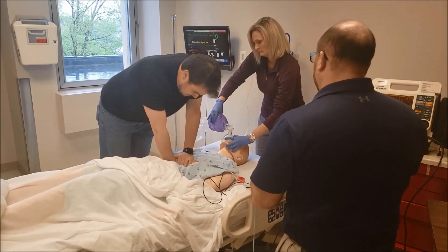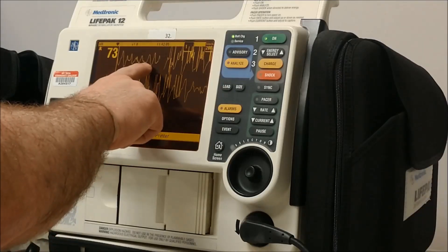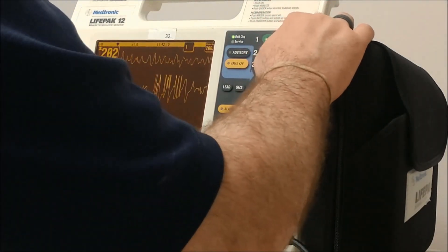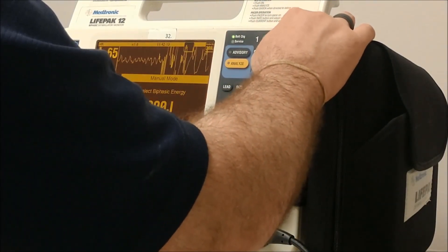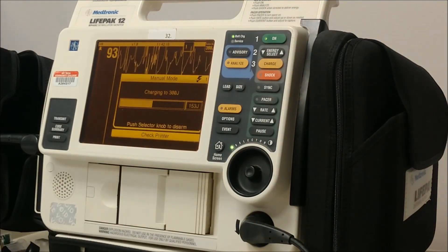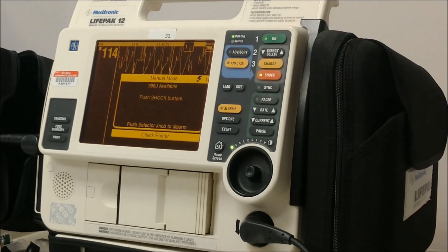It's been two minutes. Let's reassess our patient — let's look at our underlying rhythm. We're still in a very coarse V-fib. We're going to defibrillate. Start CPR again while we charge — we're going to increase our joules, go to 300. Continue CPR while we charge, and now we're going to deliver the shock.